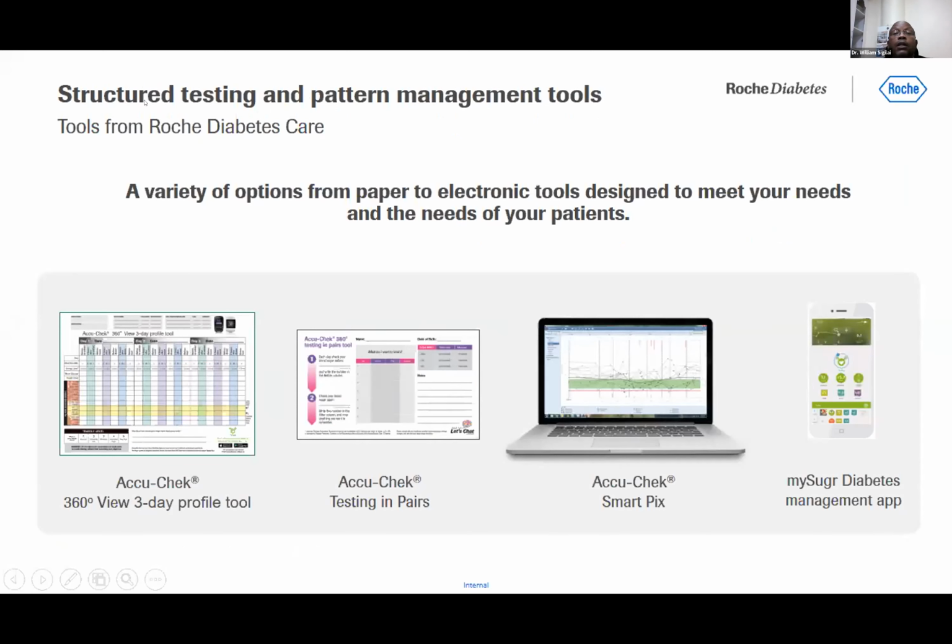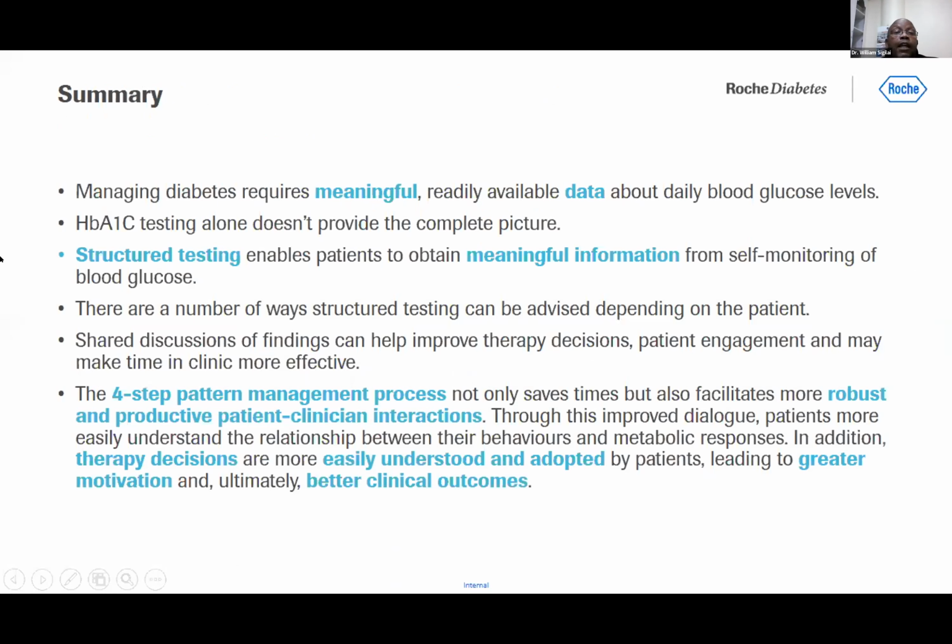So in summary, colleagues, managing diabetes requires meaningful, readily available data about daily blood glucose levels. HbA1c testing alone does not provide the complete picture. That cannot be overemphasized. It's important, but not enough. Structured testing is very important and enables the patient to obtain meaningful information.